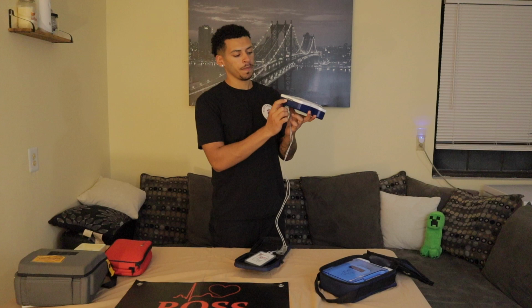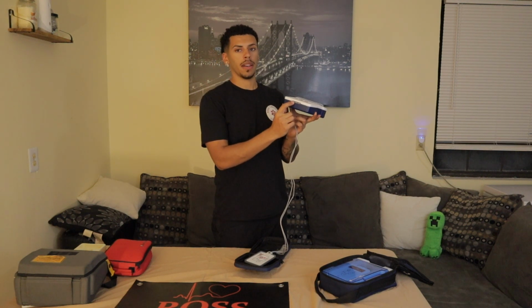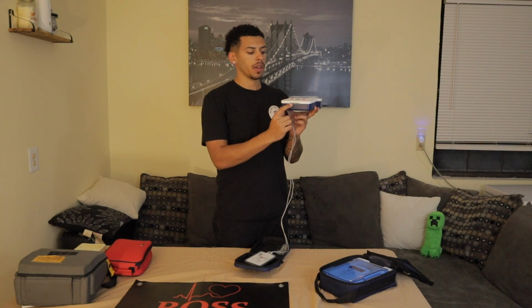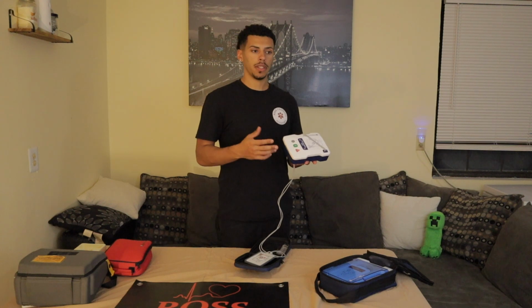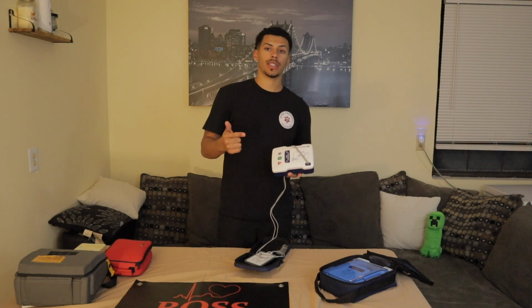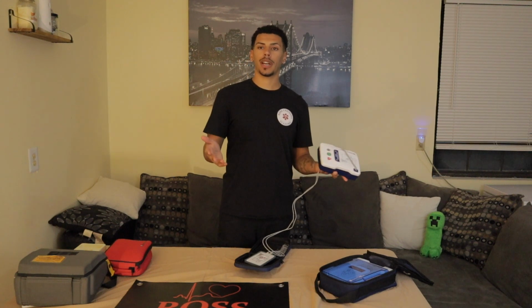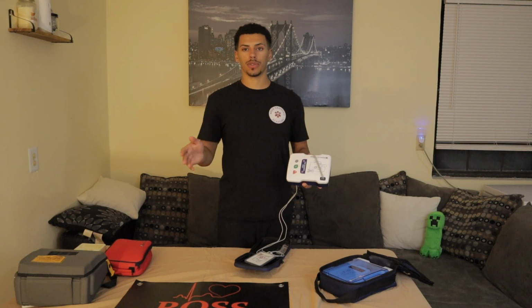Down here on the bottom, you have a few different buttons. You have your volume control and then your selection button for the different scenarios. And again, there's 5 different scenarios, I believe. And it's just like no shock, no shock, shock, shock, shock, shock, just different types of scenarios every 2 minutes during those rhythm checks.